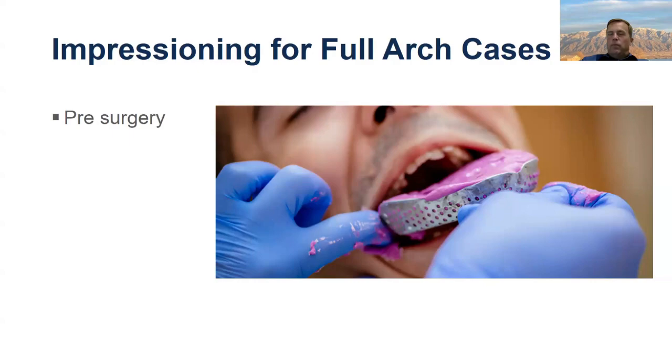Full arch. So let's say you're partnering with a surgeon, and you're doing the pre-surgery impressions. Two major things I would say with this. The first thing is take crown and bridge level impressions with denture border. So basically, you got to take impressions like you're doing a partial. If the surgeon's going to use guided components, the guided components sometimes fit to the teeth.